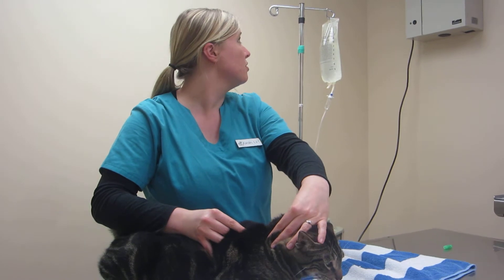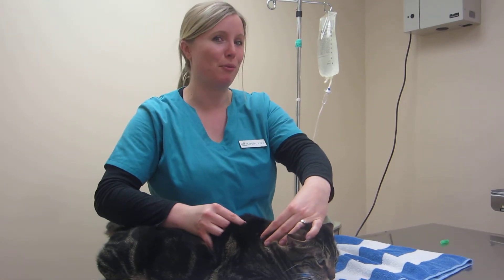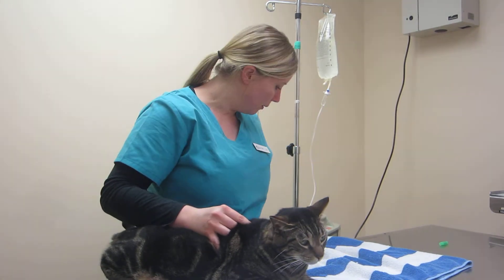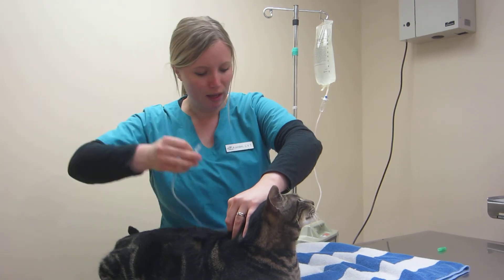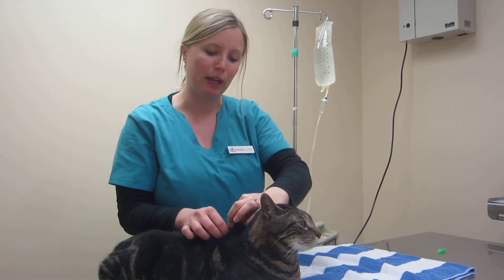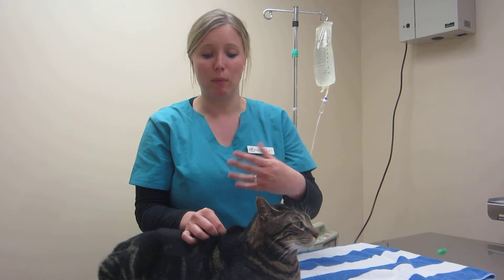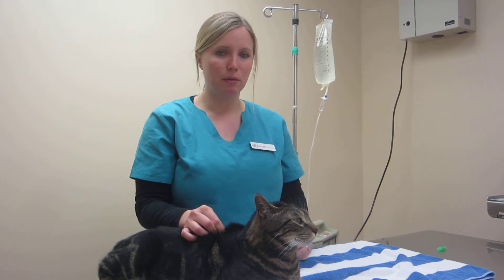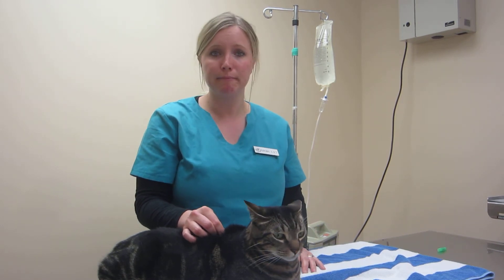Let's say you're going for 100 mLs — you're going to sit here until that fluid line up there is almost down to the two. So we're going for 100 mLs. You can see there's going to be a bubble forming, which is normal, and there shouldn't be any leakage around. Once you're done, you're going to go ahead and close your line first, then gently pull out your needle. Go ahead and recap it and set it down on a clean surface. Usually I just pinch their skin a little bit — not to the point where it hurts — just to help close that hole we just created. We don't want a lot of leakage afterwards. If there is some leakage after you're done, that's completely okay — it shouldn't be more than just a couple drops and it should resolve fairly quickly.